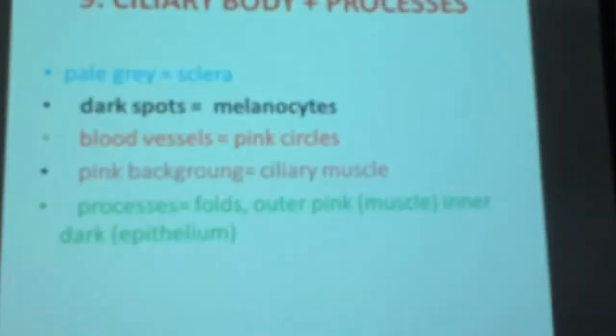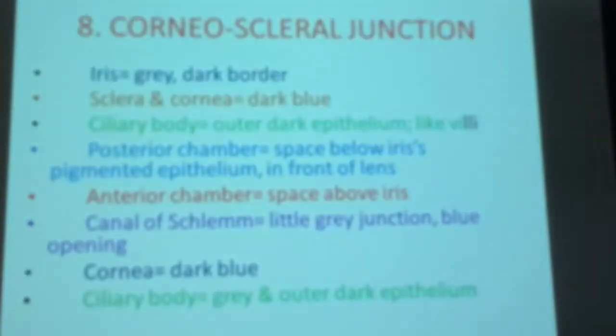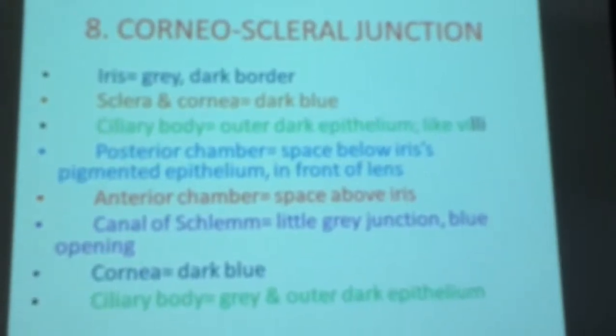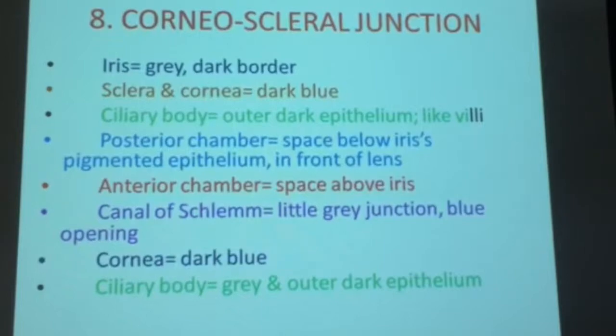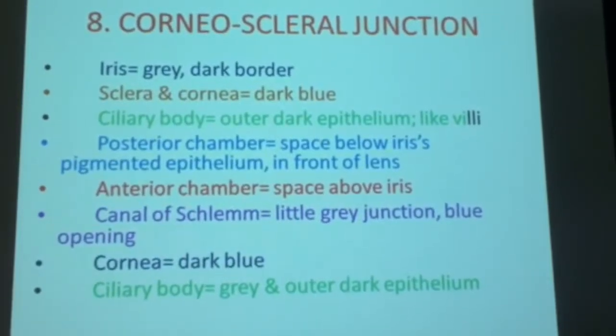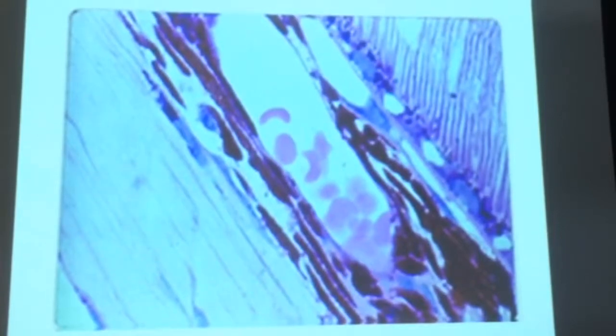Could stop for a second. To the retina. There, right. Good. Back one. Okay. That's it. Okay, so make sure you see this. So we're going to look at this one again on the previous page. So go back. Okay.